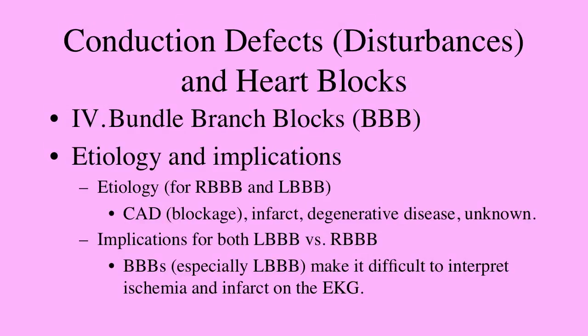So that's the information on bundle branch blocks, and I think one good thing in that area is they're fairly easy to see on the EKG, and they are fairly distinct from other things and from each other.